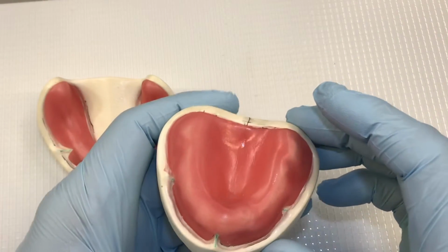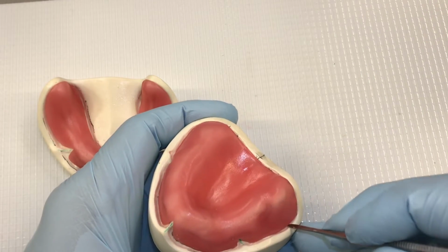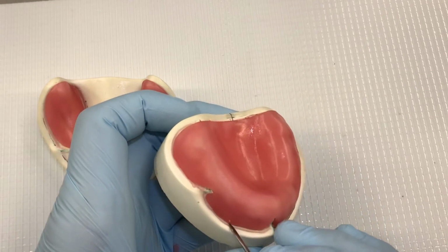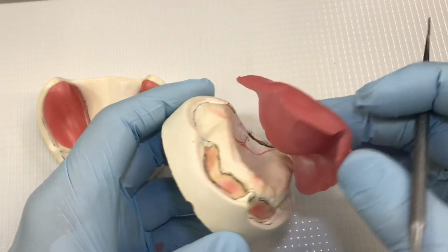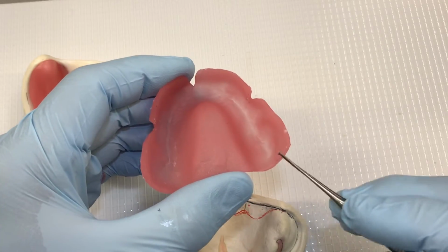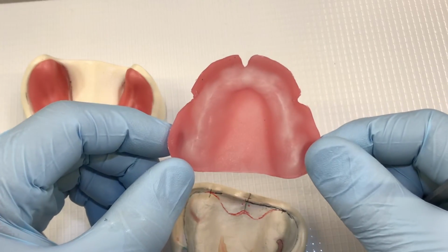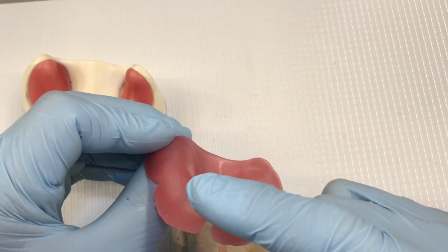Now this one here has cured already, so you can use an instrument. Be careful not to damage the model, and if you did your block out properly, this should just pry right off very gently. This particular case, we don't have excessive undercuts, so this came out rather nicely. There's a little bit of hint of the pencil that I was telling you earlier, but not too bad. So this has to go back in for another 30 seconds. And you can see where I thinned it out to minimize some of the interference I'm going to have when setting up the teeth later on.